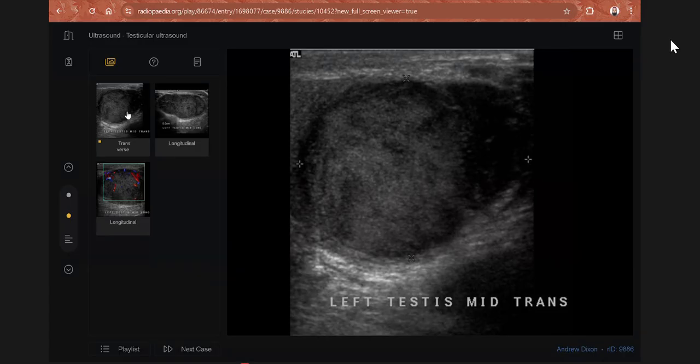So, sir, I would inform this to the referring physician, and I would like to recommend MRI for this patient if there is any history or suspicion of testicular CA before. But considering the radiological findings, it appears more of an orchitis because of the striated appearance as well as the heterogeneous echogenicity and increase in size, most probably. But this patient has had the pain for 2 to 3 months. Sir, then the possibility of underlying carcinoma or malignancy should be considered.